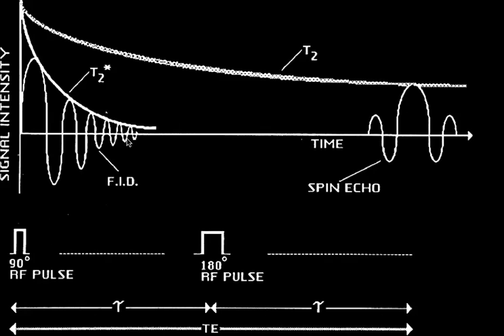Yeah, basically, if you kept your receiver on after the T2 star decays down, and if we turned it on before the 180-degree pulse and listened all the way out, what we would see is a huge signal with the RF pulse. Then there would be no signal until we get very close to the TE time, which is the 2 tau time here, within a few milliseconds. And then you'd start getting a signal. It would be weak at first. It would grow to a maximum. Then it would become weak again. And then it would go away and you'd have no signal. And that's the nuclei rephasing.